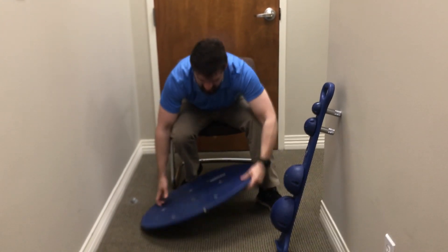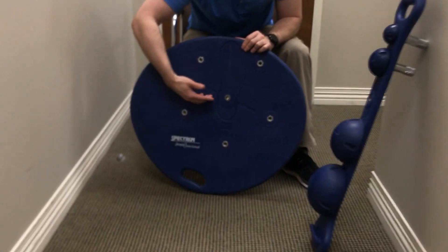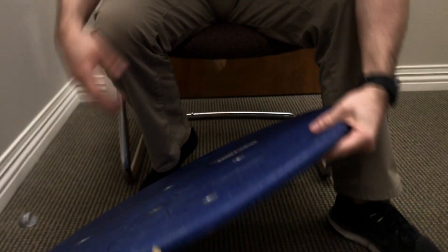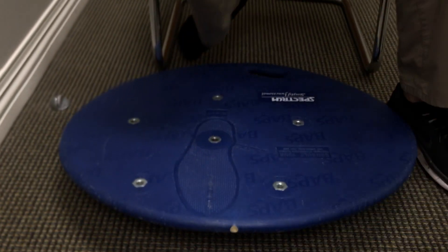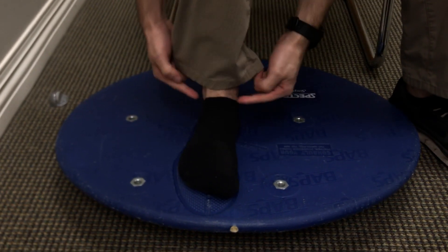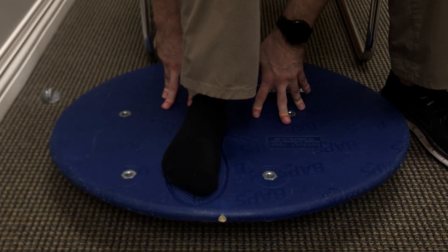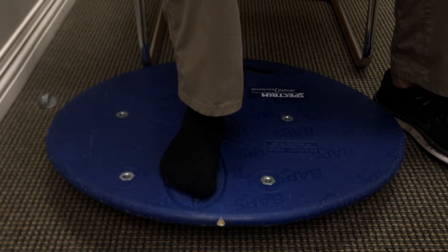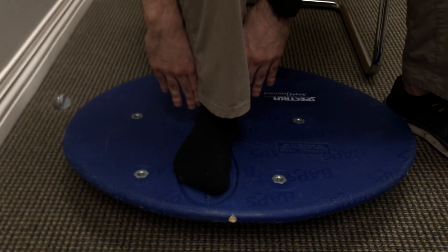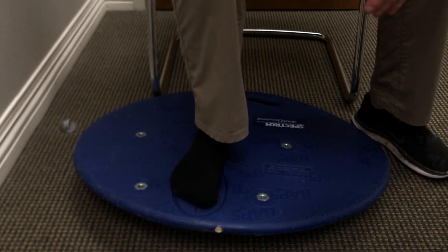To set up on the board, you have this outline of the foot with these markings that show where to have the ankle lined up. When you place this on the ground, you're gonna have the patient put their foot in the outline on the board. You want to be sure that their ankle bones are lined up with this line that's cut out in the board. And then you want to have the lower leg lined up directly over the ankle, so they're not sitting back with the leg straight — you want to have it directly on top of the foot.